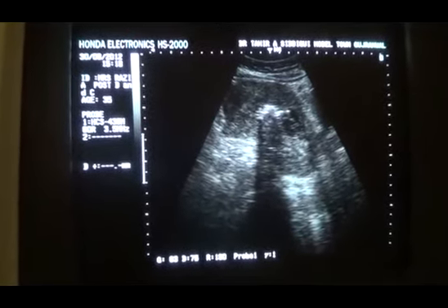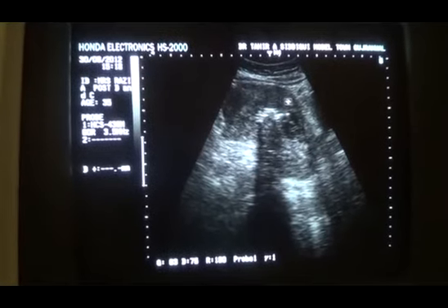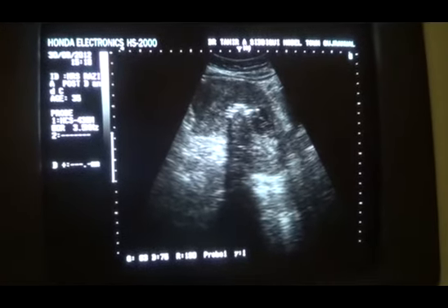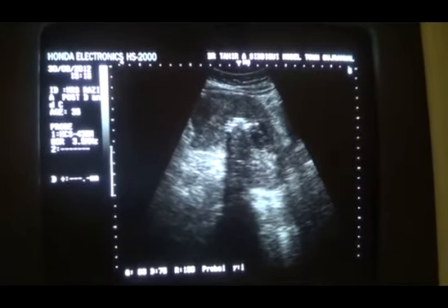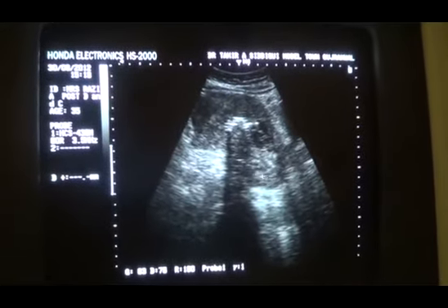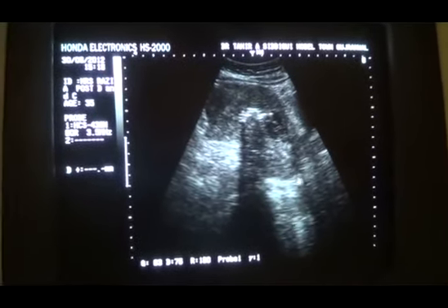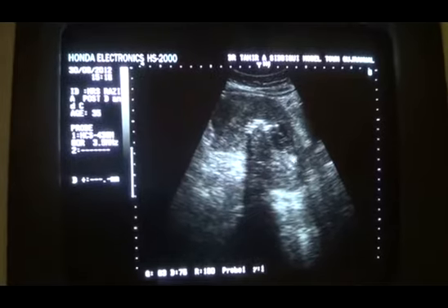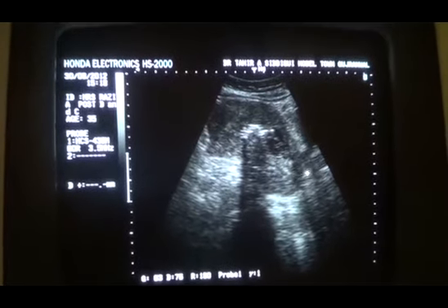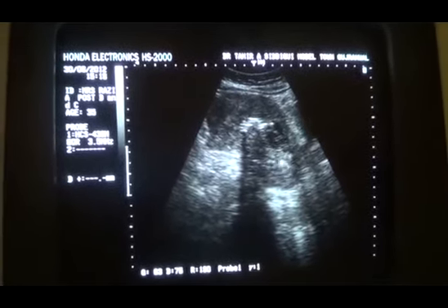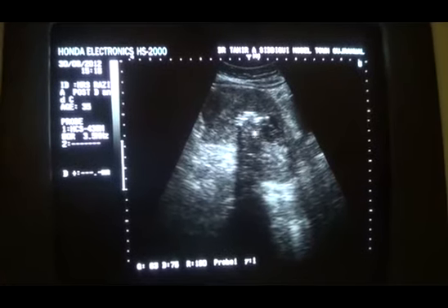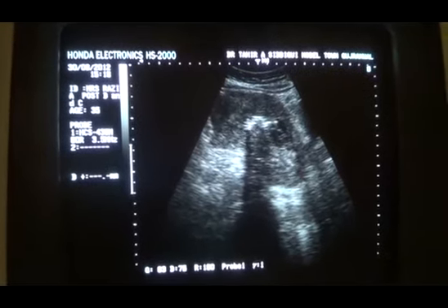You can see the anterior myometrium, the fundus of the uterus, the posterior myometrium, the posterior lip of the cervix, the anterior lip of the cervix, this is the vagina, and the cervical canal is doing fine — there is nothing in it.